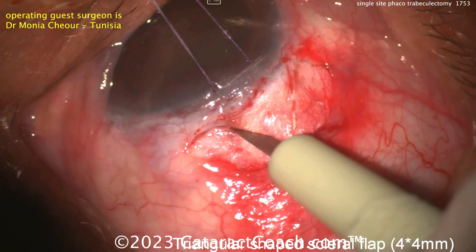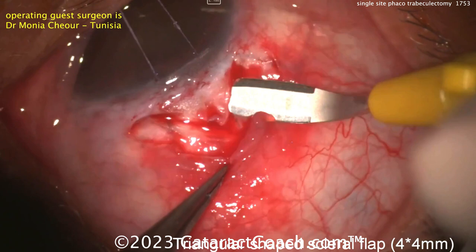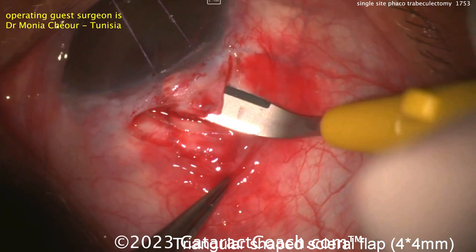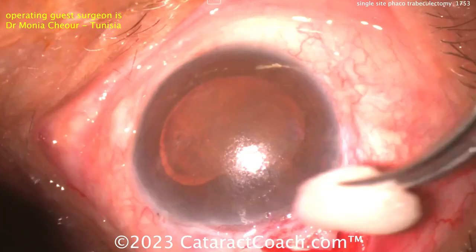Here comes the creation of a scleral flap — triangle shaped in this case. Using a crescent blade now to go half scleral depth and create that opening. Half scleral depth, and then getting that a little bit more advanced anteriorly. So there's your flap — we're going to use that for the trab site.